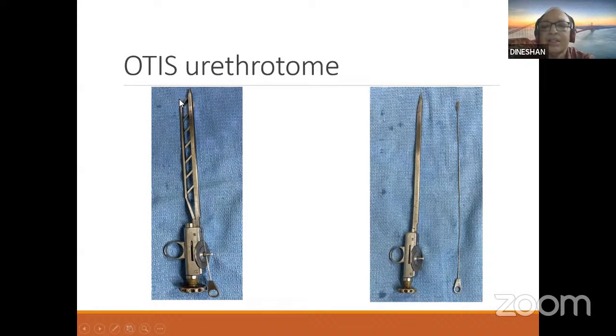And here at the tip, you can see there is a small knob. This can be removed, and then you have a small holder. In the olden days, urethral dilatation was done using filiform dilators.